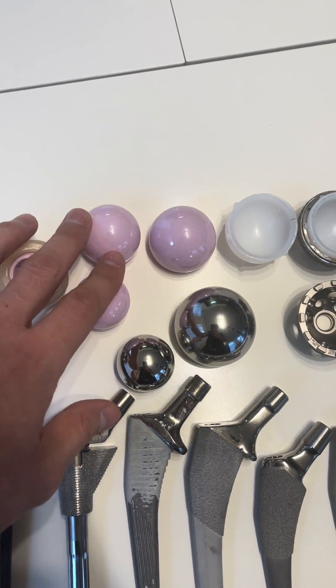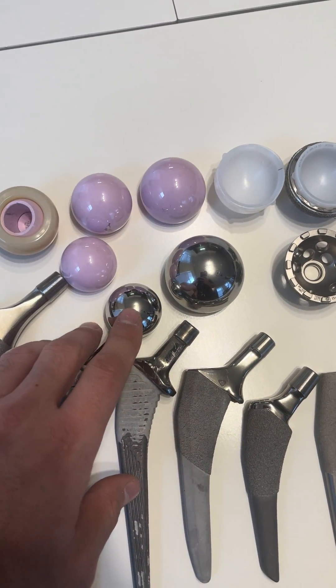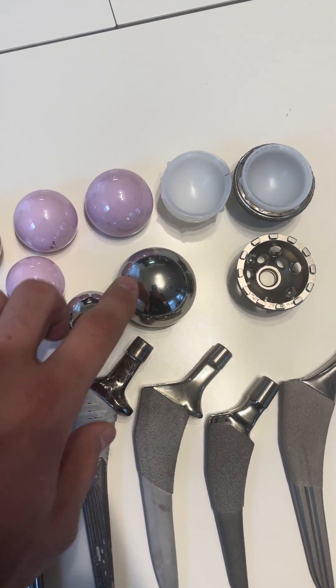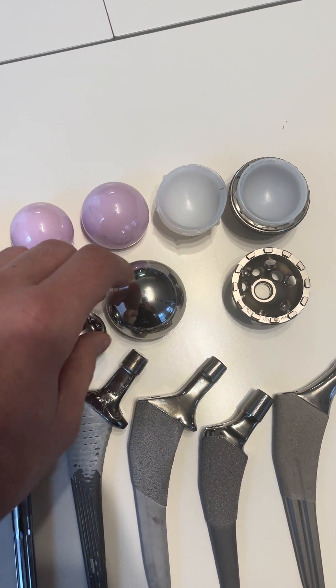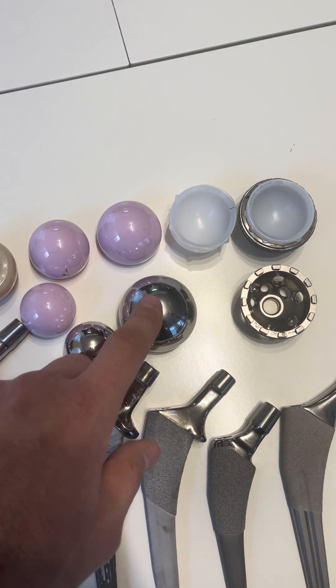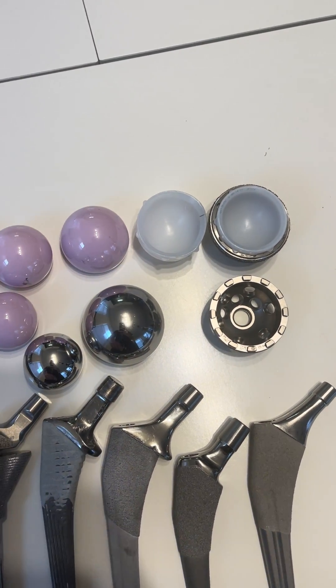These are other ceramic heads. The larger the head, the lower the dislocation rate. Metal heads are not really used that much anymore. This is what we call a hemiarthroplasty, or partial hip replacement type head, where you're not using a cup — you're only using a large metal head — but most of the time I'm doing total hip replacements.